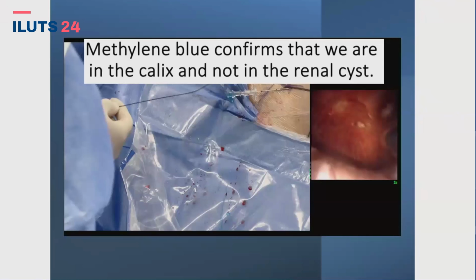In this case, I try to play with the guide wire in order to advance it to the upper calyx, and if it's possible to go down the ureter. If it's not possible, and I'm sure that I'm inside, I try to make the dilatation and introduce the nephroscope to break the stone, with a lot of care to not lose the guide wire. Danny, what do you think?